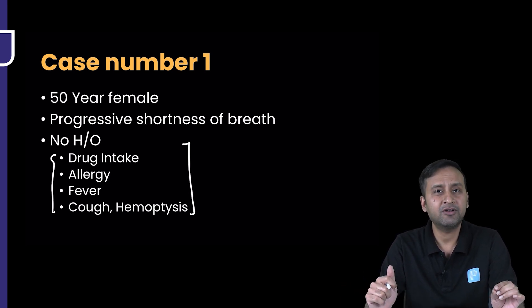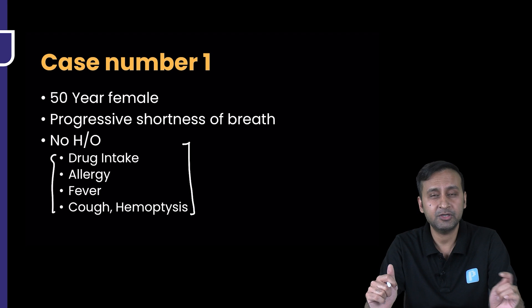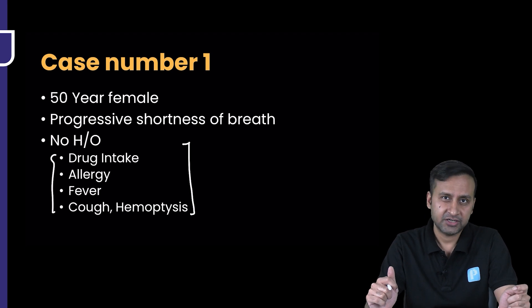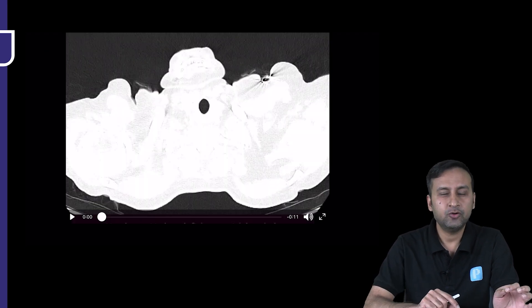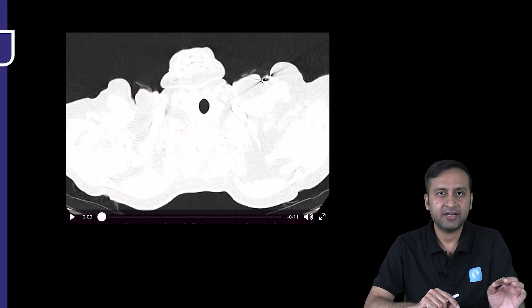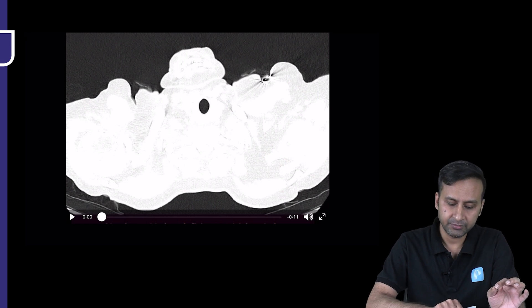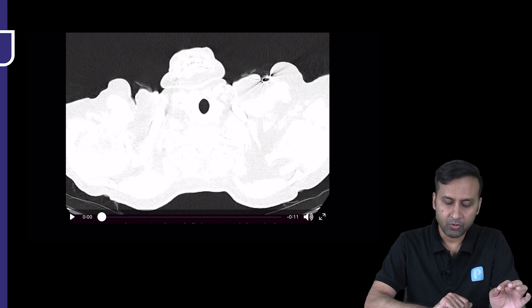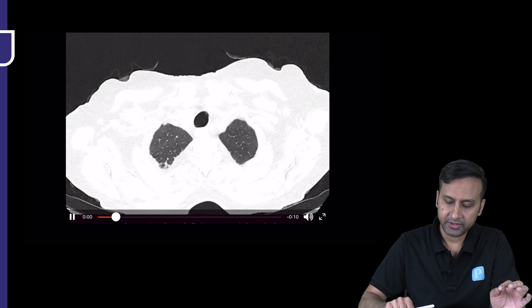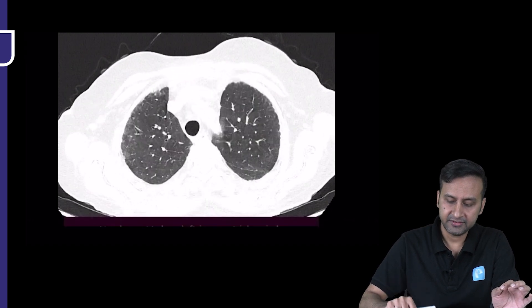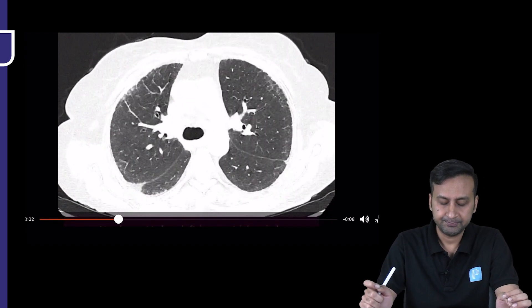I want you to have a look at the cine image of the HRCT of this patient. This is the cine loop — it starts from the lung apex and thereafter goes to the lung base. I want you to look at this image from top to bottom and jot down the important findings that you can see.